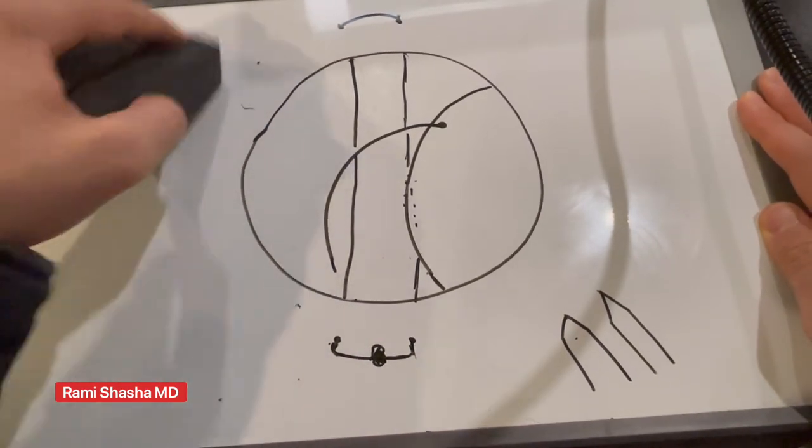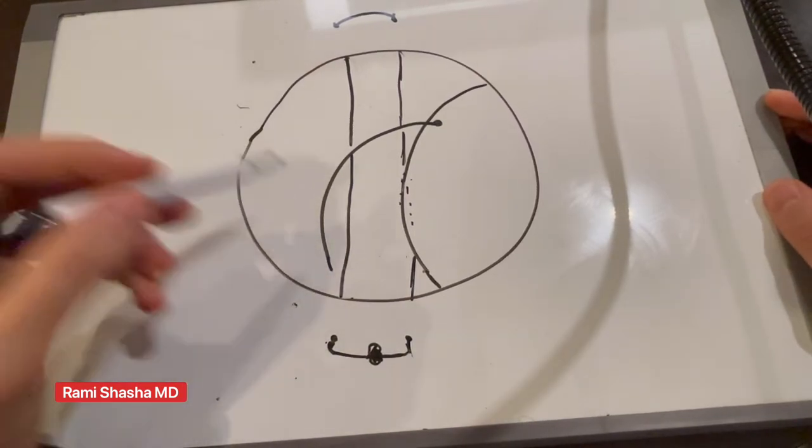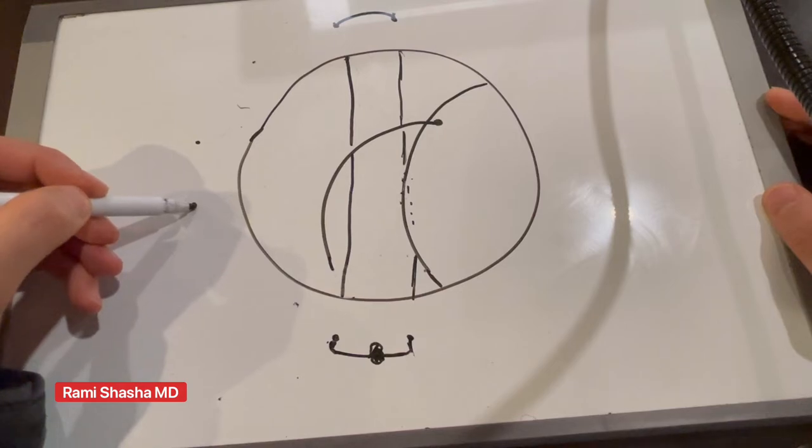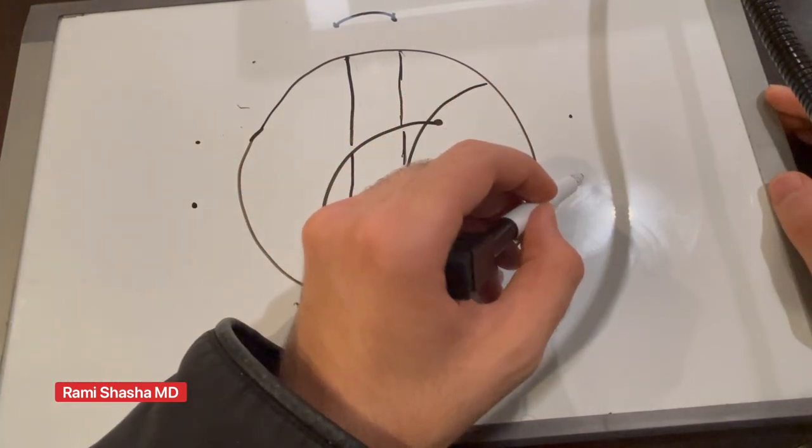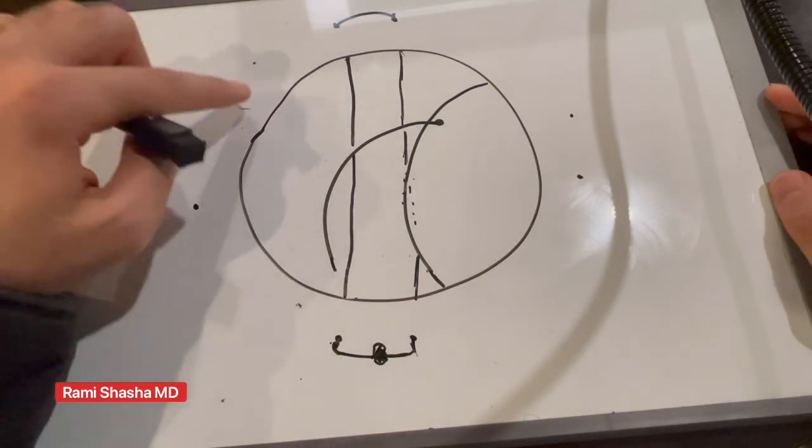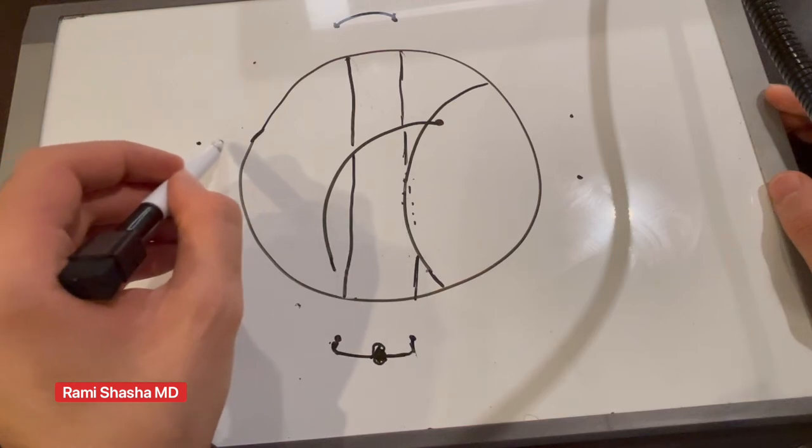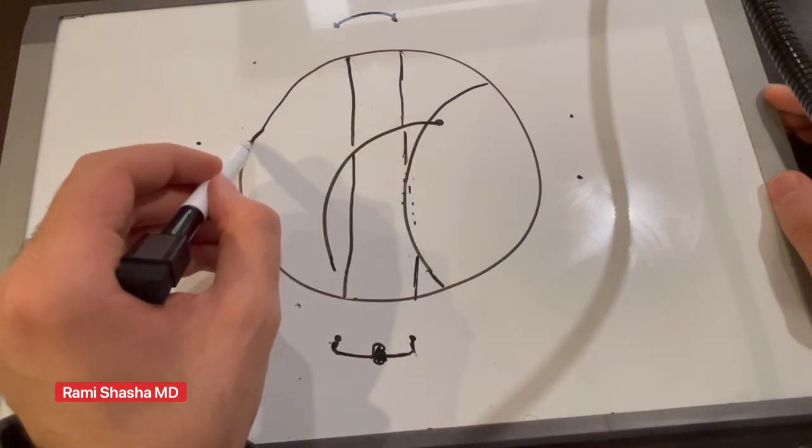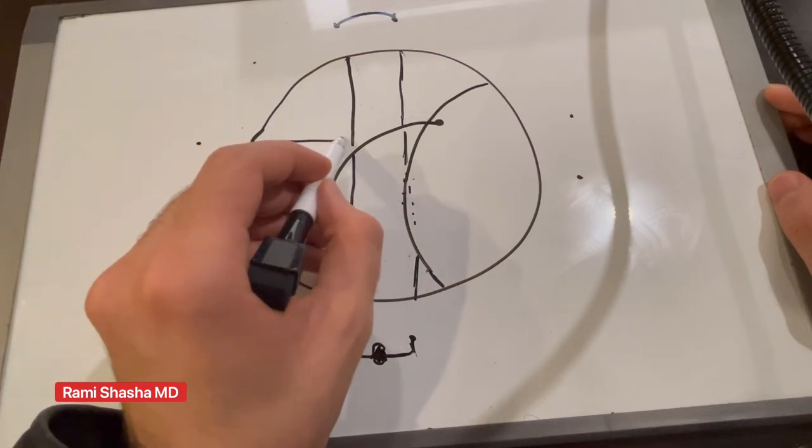You could also, and often this is more than enough, you can actually repeat the same thing on the other side. So again two millimeters from the limbus and three millimeters across, and you can do the same exact thing I just showed you with the needle and the 27 gauge hypodermic needle.